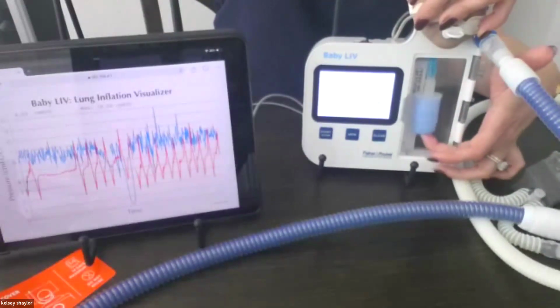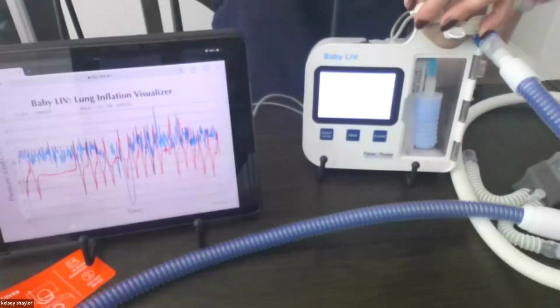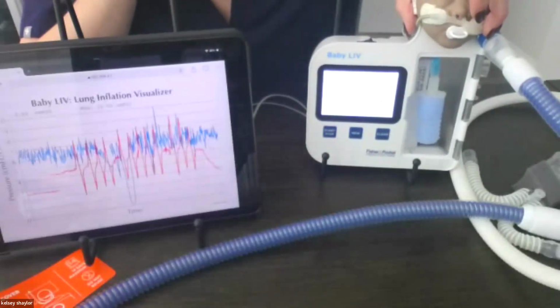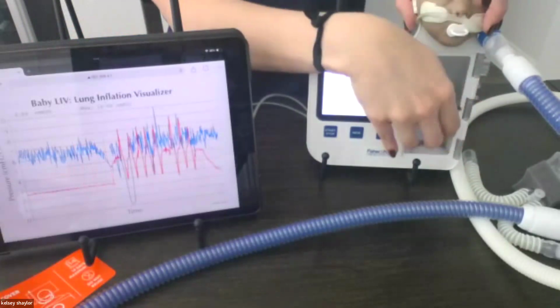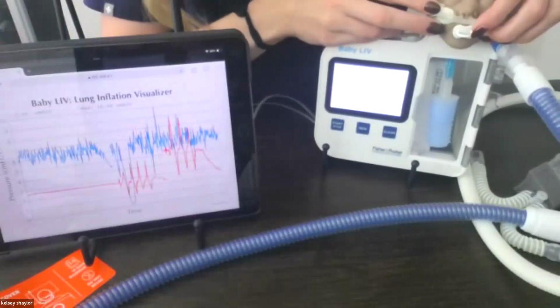But you do want to note that we never hit 0 in terms of pressure on that inspiratory side, right? So obviously our pressure drops, but when we're truly meeting or exceeding that peak inspiratory flow demand, which is again the main goal of high flow so that we can see the benefits of it, reduce that work of breathing, actually provide a little bit of that positive pressure. We want to make sure we never hit 0, right? We never want to fully lose that recruitment we're trying to provide with high flow.